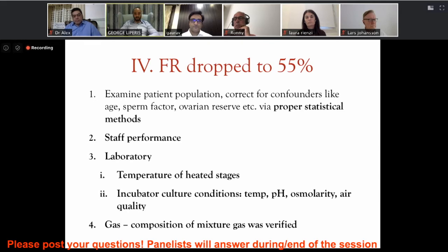It's also very important to check the composition of the mixture of the gas. So we need to use a standard gas before we take any measures, especially if we're using, for example, a mixed gas. We have to validate that the gas comes with certificates of analysis from a reputable provider, because the quality of the gas can be very, very important. We can also take readings of the gas using a gas analyzing device. And it is very important, before we take a reading, to measure a standard gas first, in order to calibrate and make sure that it's functioning correctly.